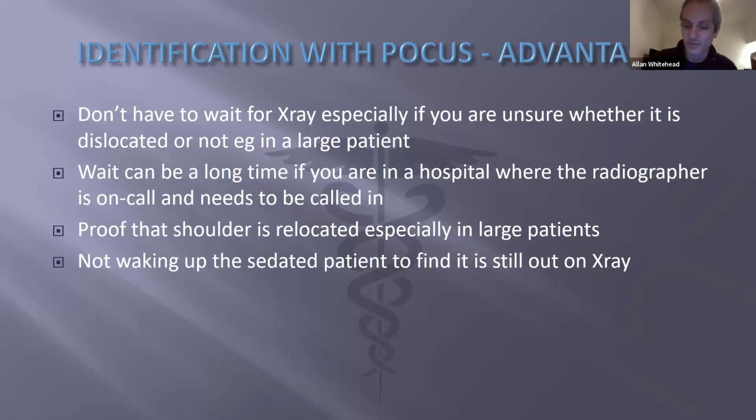That's something we'd try to avoid if possible. Not the end of the world, but it is a bit unfortunate if that happens. So again, ultrasound can give you that answer by the bedside about whether the shoulder's in or not after you've done the procedure, if you're not certain. Okay.